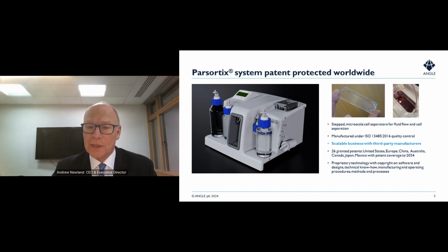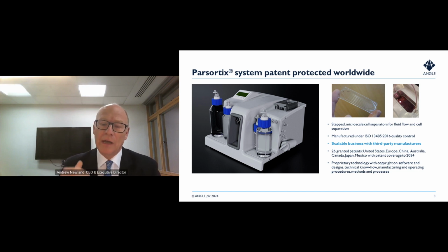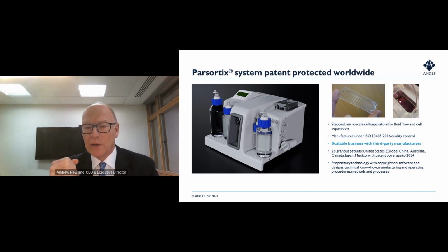And what we demonstrated with data that we presented in January was that if you look at the living cancer cells, intact living cancer cells, the circulating tumor cells, which you can recover with the Parsortix instrument shown in this slide, then you can get additional DNA variants, in fact, actionable DNA variants, which are not found in the ctDNA, the dead fragments of cancer cells. And hence, these can be representative of the clonal evolution of the cancer, how the patient's cancer is evolving and evading the current therapies and evading the immune system so that the cancer is spreading.